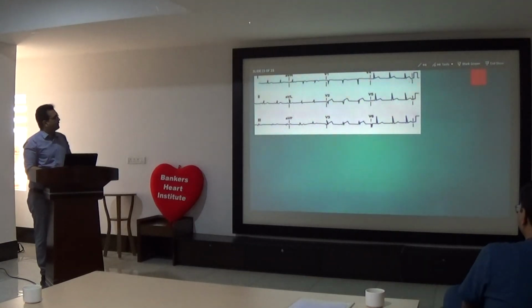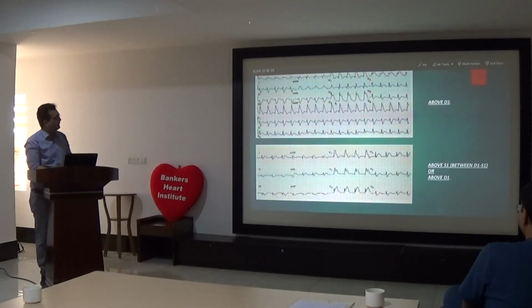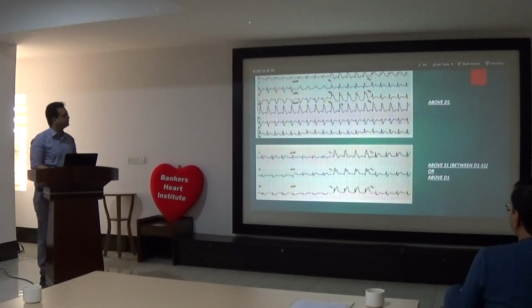In that first ECG, go to previous slides. The first ECG: suppose fortunately this patient is not in failure and blood pressure is acceptable. Apart from your thrombolytics or opening of coronaries, which most important drug will you give first? Look at the pulse rate.